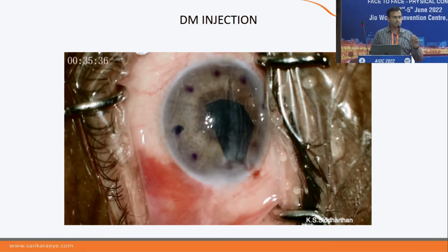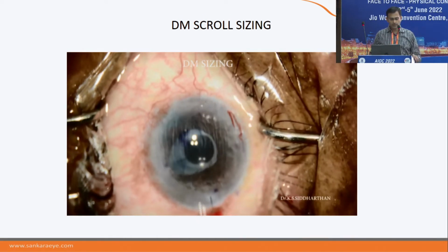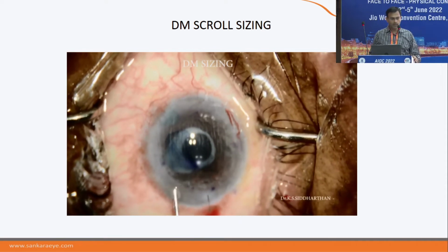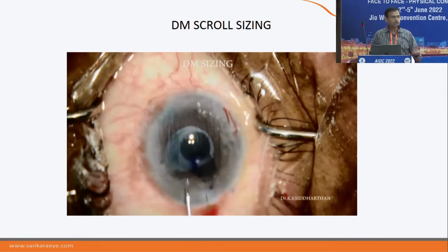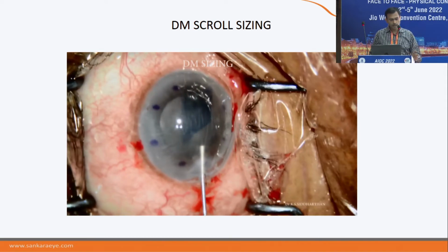So first, the sizing of your tunnel is very important. The second is your scroll size. These are very important, because here I am making a mistake: this is a 5.5 to 6 mm opening, and I am using a graft of 7 mm. You see that it always goes and impinges around the pupil, and it will not open. In an experienced hand it will open, but when you start it's going to be difficult.